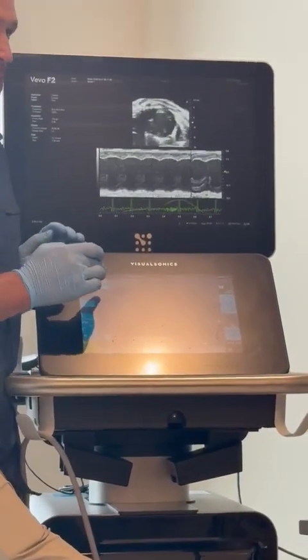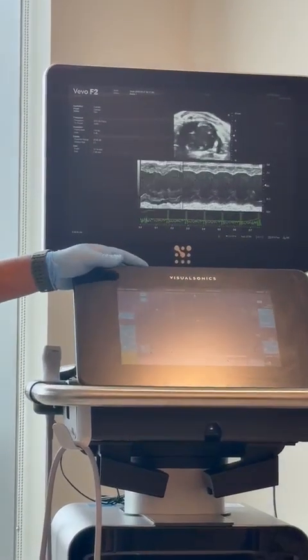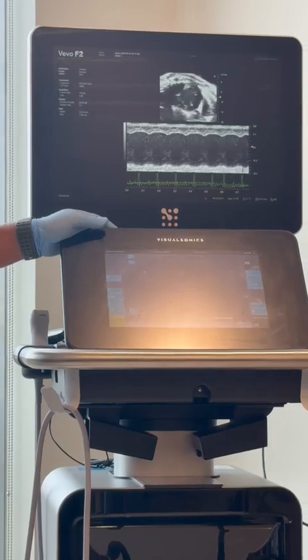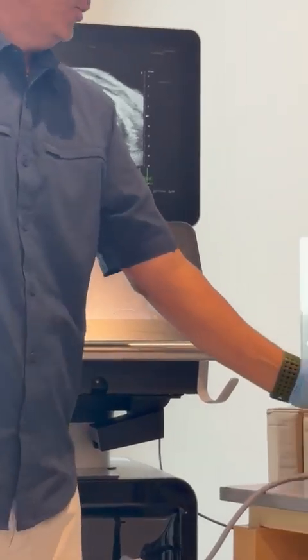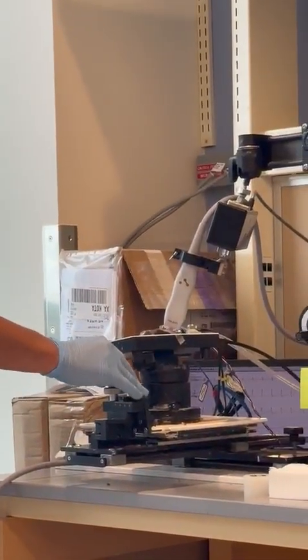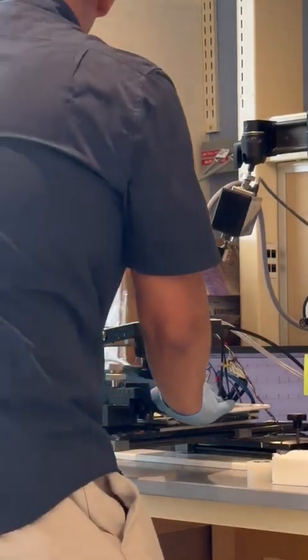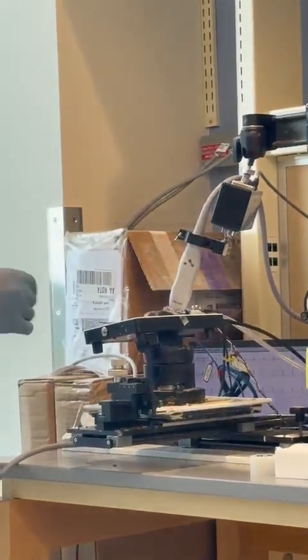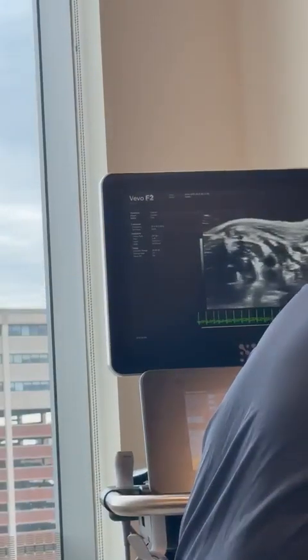While we're here, it's a really easy acquisition to do pulmonaries. So do we want to do that now, or are we going to save it for the afternoon? Does anybody care about pulmonary artery? Yes. Okay, so to do pulmonary artery, all we're going to do is take our Y knob, and we're just going to turn it clockwise and bring the animal towards us. And when we do, oops, not enough, of course. Some black line right here, and I want to bring it a little bit further so we can actually see.